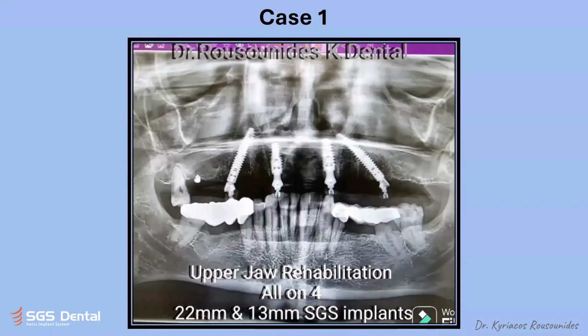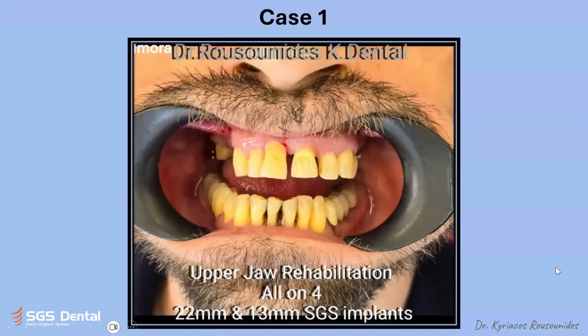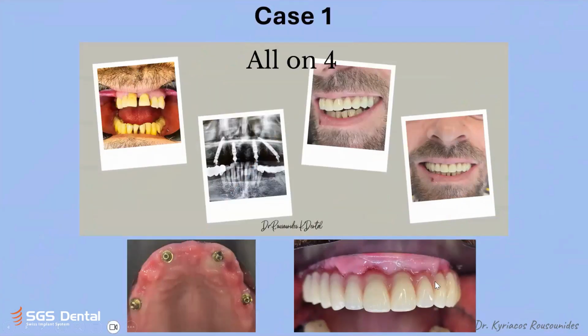And we have also some pictures of the final restoration at the end. Here is the final restoration. This is 3 months after. I saw the patient some days ago. He likes to do the lower the same way. And we see here the result, and we see here the fake papilla in an FP3 case. The fake papilla stays. It's still in place.